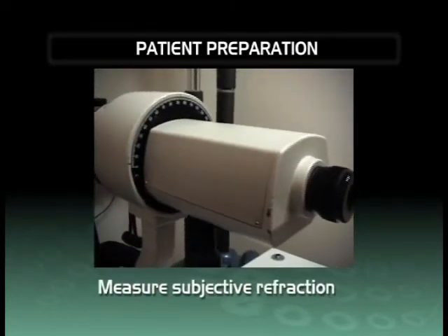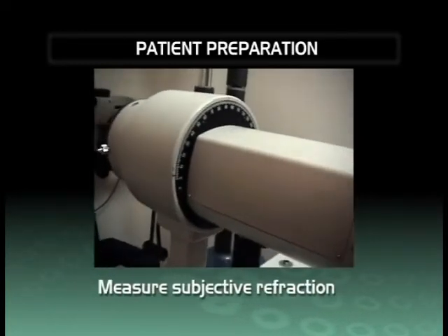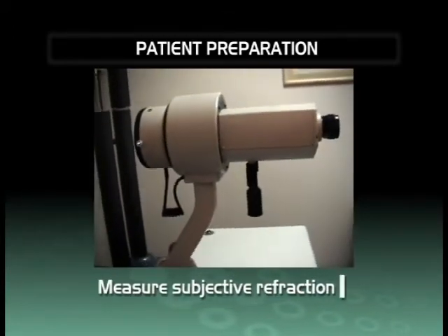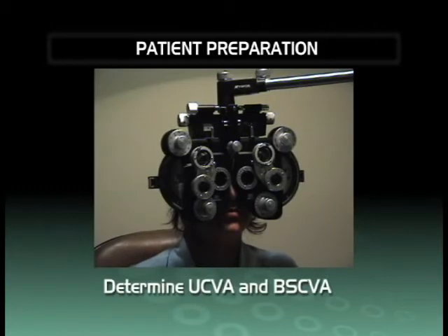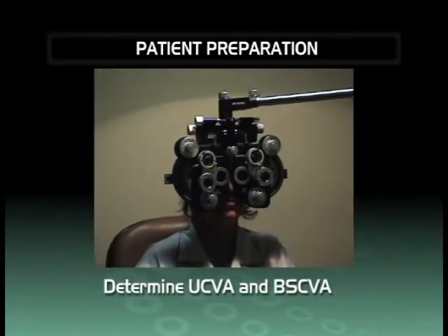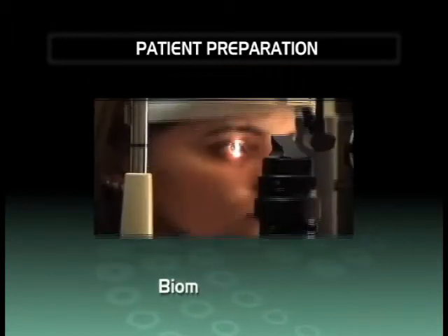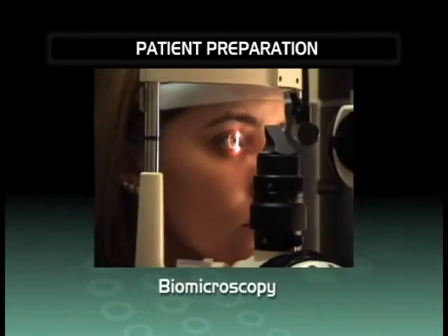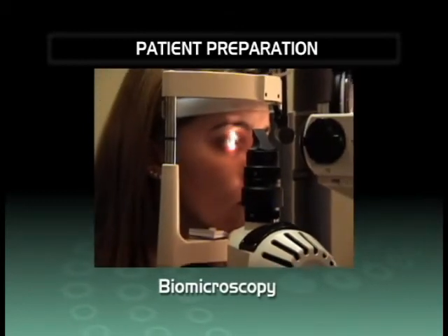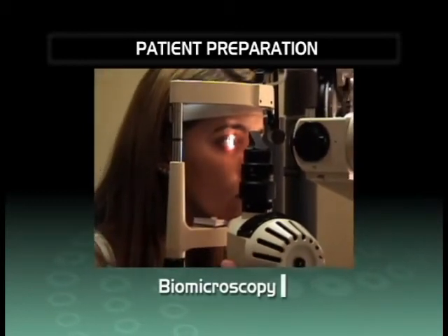It is important to take the manifest refraction as accurately as possible. Do not use autorefractometers. Determine uncorrected visual acuity and best spectacle corrected visual acuity. Perform a complete slit lamp examination to assess the cornea condition and presence of corneal opacities.